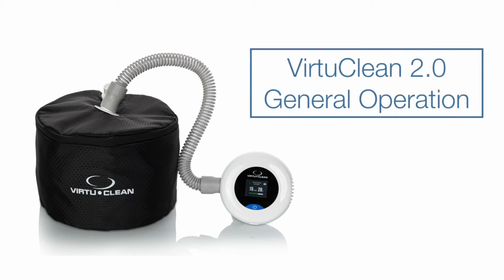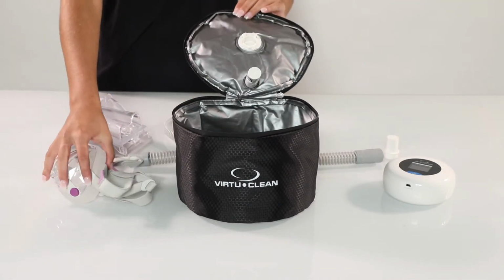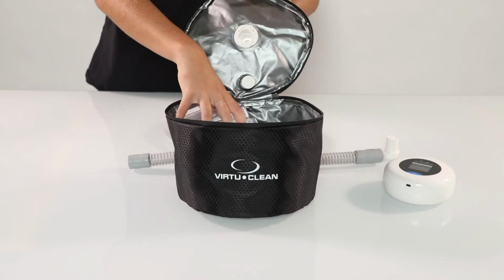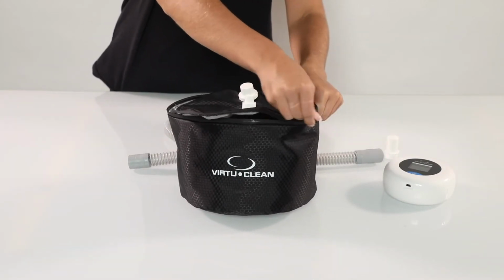This instructional video covers general operation of your VirtuClean 2.0 system. Open the top of the VirtuClean sanitizing bag and place your CPAP mask and humidifier chamber inside. Be sure to first empty any water from inside the humidifier chamber. Zip the bag closed.